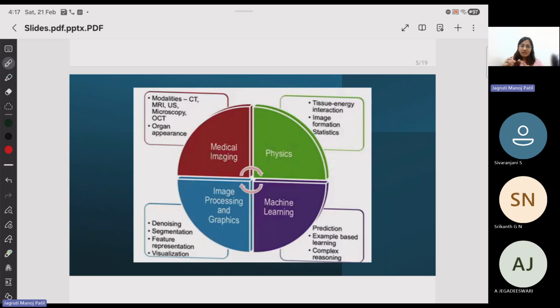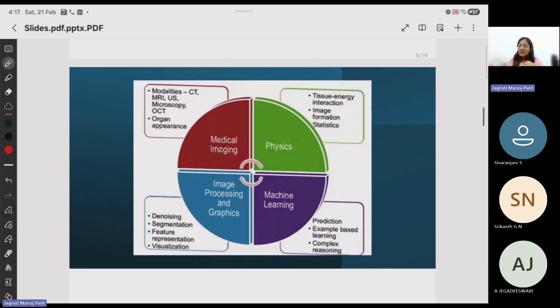Then you have ultrasound. Everything in ultrasound is just a sound wave propagating, but for the other modalities, CT and MR, you go into a gantry and image yourself. In terms of MRI, there would be multiple magnets around you and then multiple magnetic detectors, so that's a big gantry. For CT also, you have the same thing. X-ray doesn't attenuate in air, so if you just stand before the source and your detector is behind, it would give you a pretty nice image. Ultrasound doesn't work in a similar manner.